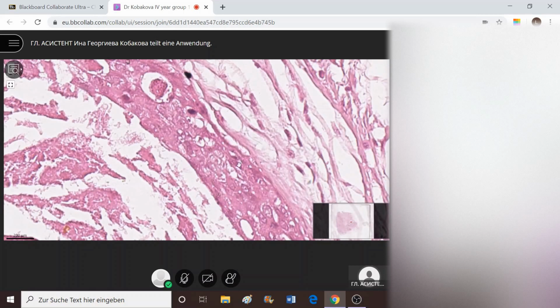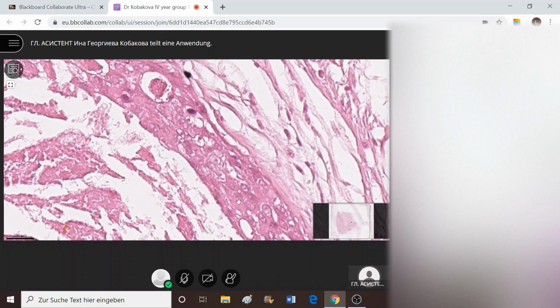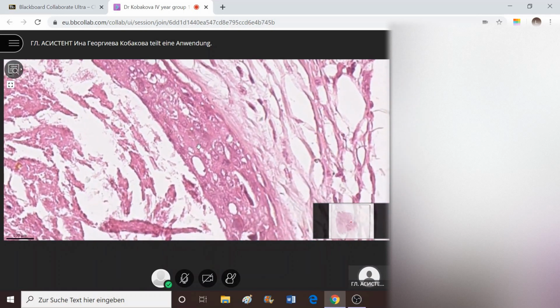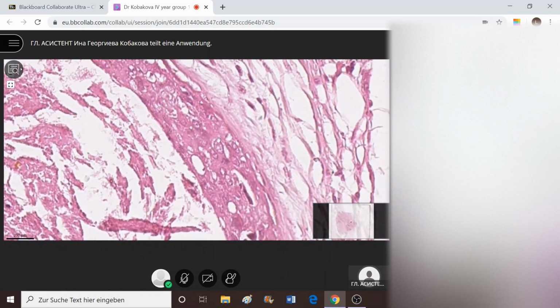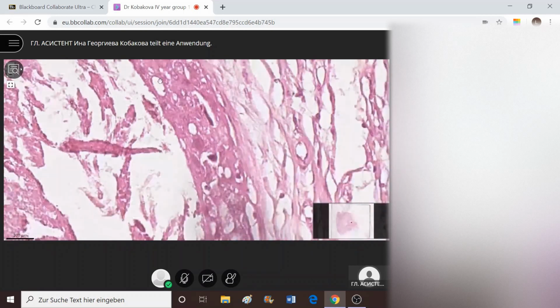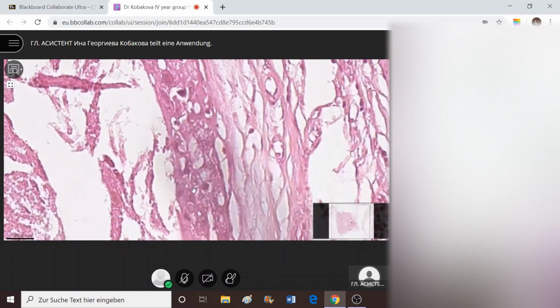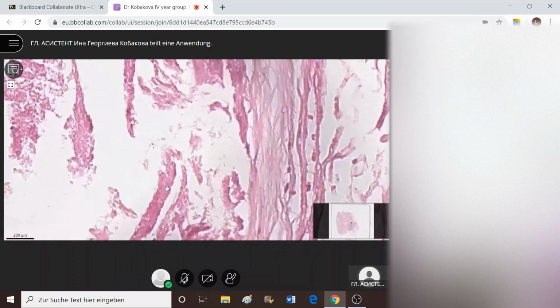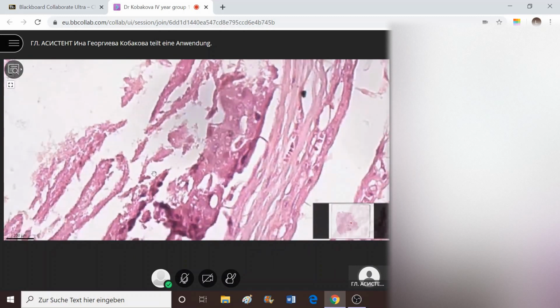Those are the myoepithelial cells and the epithelial cells, which are positioned more apical. So here, we're supposed to see, again, two types of cells, some with more dispersed chromatin and darker cytoplasm, and others which appear foamy with more light cytoplasm and centrally positioned nucleus. So we see two populations of cells which are making this type of carcinoma. As far as you can see, it's not monomorphic. I'll search for more appropriate population to show it to you.